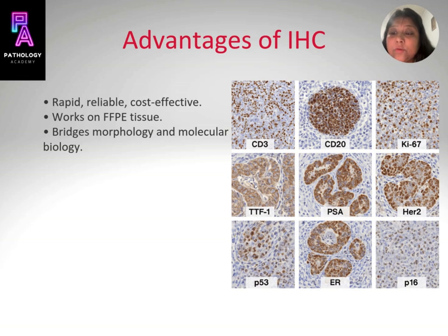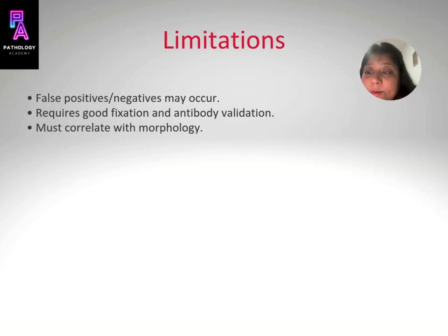IHC bridges morphology and molecular biology. It's fast, cost effective, and applicable to routine FFPE tissue, making it ideal for daily diagnostic use. However, accuracy depends on proper fixation and antibody selection. False positives from cross reactivity and subjective interpretation can occur. Hence, always interpret IHC in morphological context.